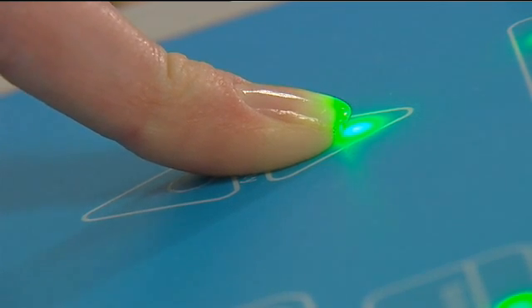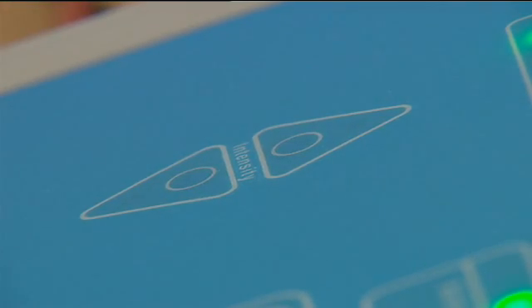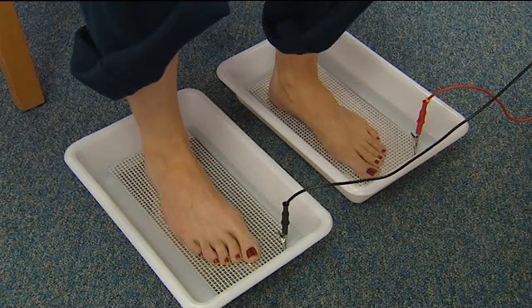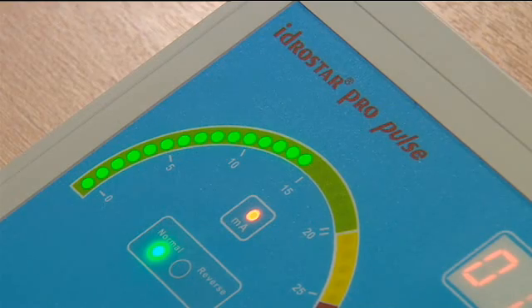A pins and needles type sensation should be felt, but this should not be uncomfortable. At a certain level, a slight discomfort or pricking will be felt. Ensure that the current is not turned up too much as this treatment should not be uncomfortable.